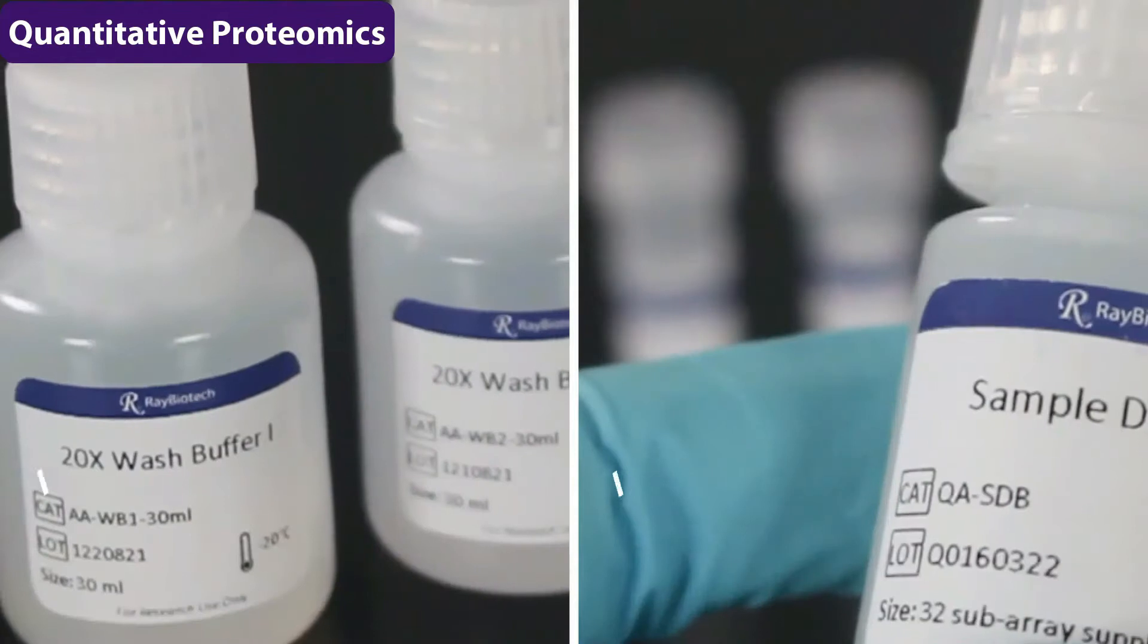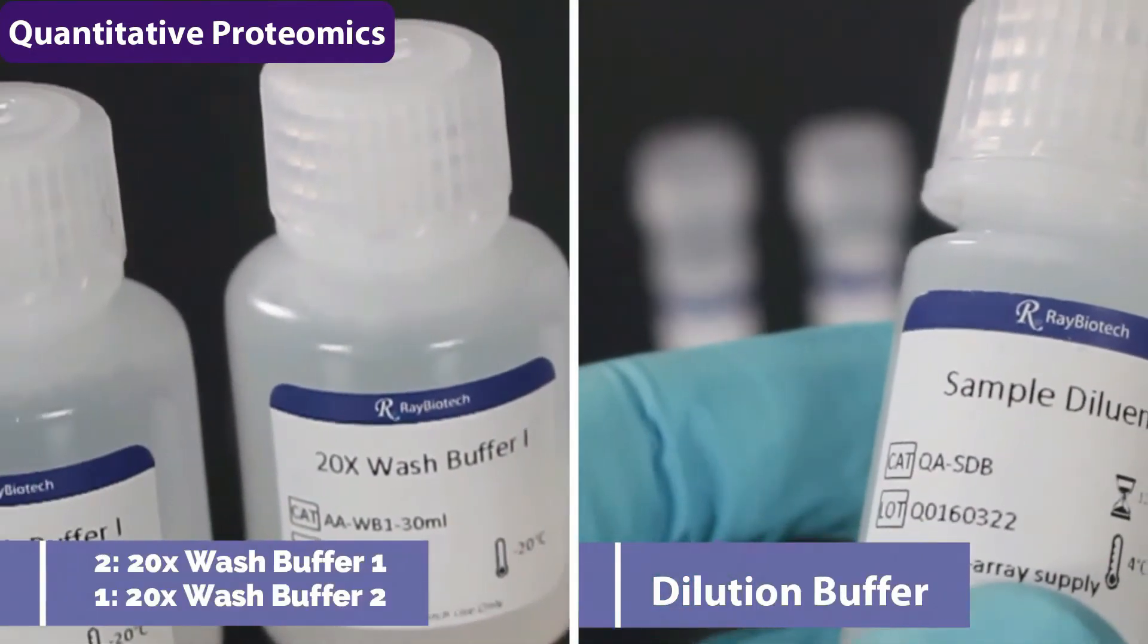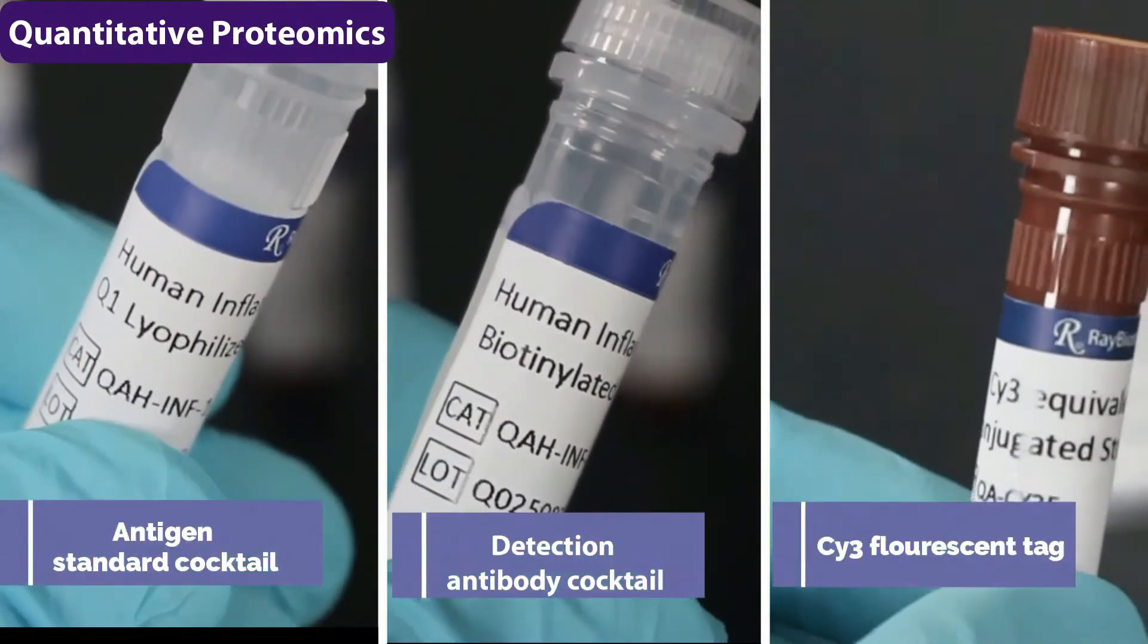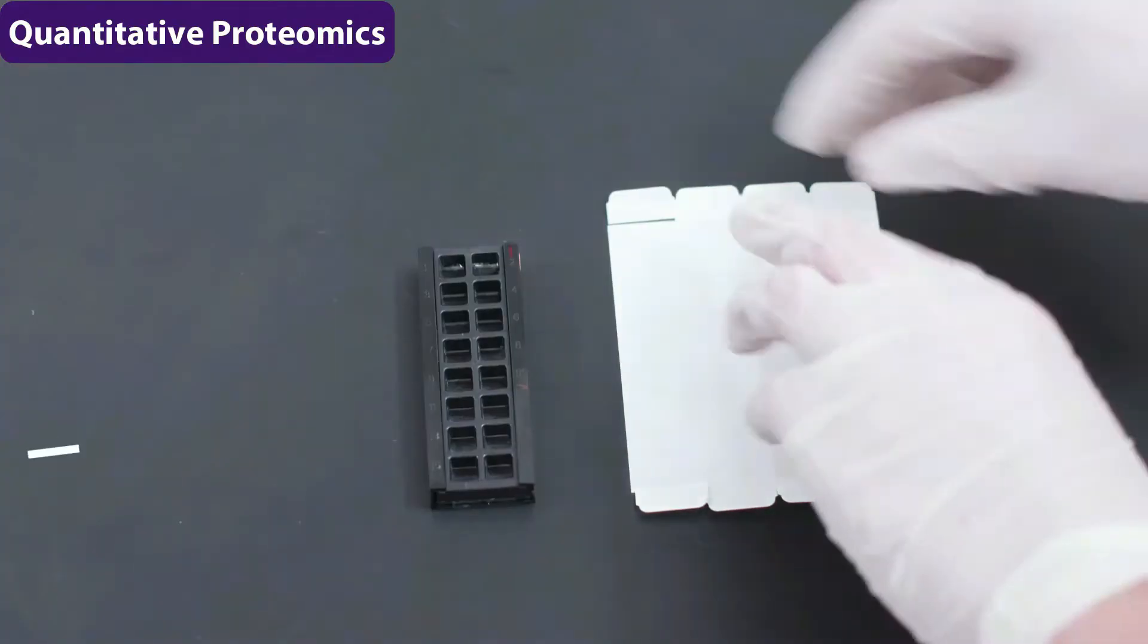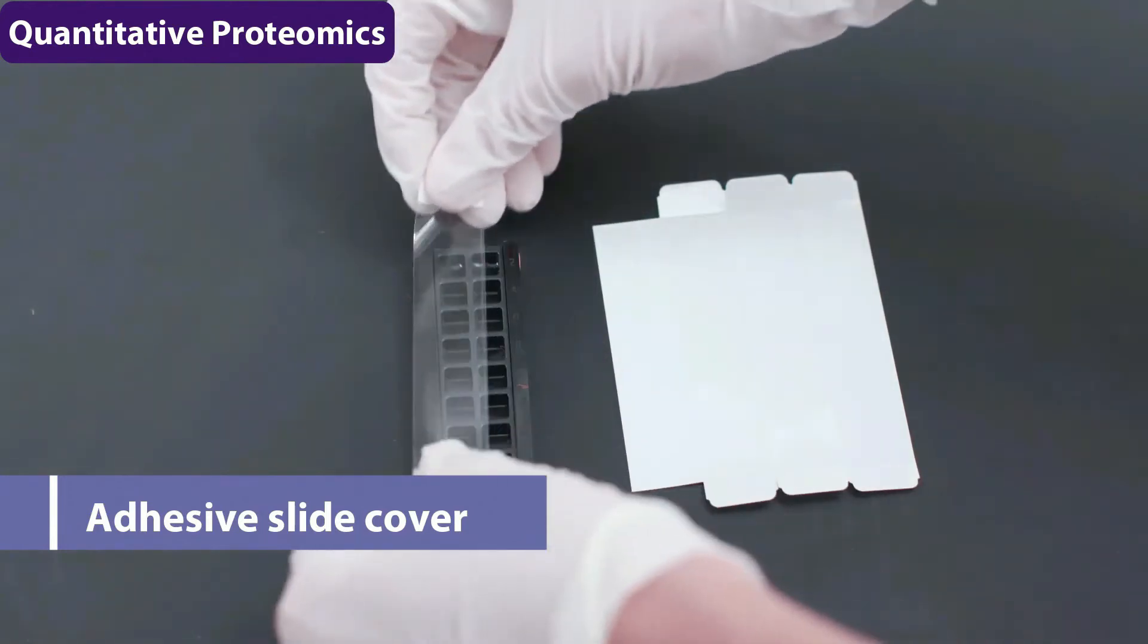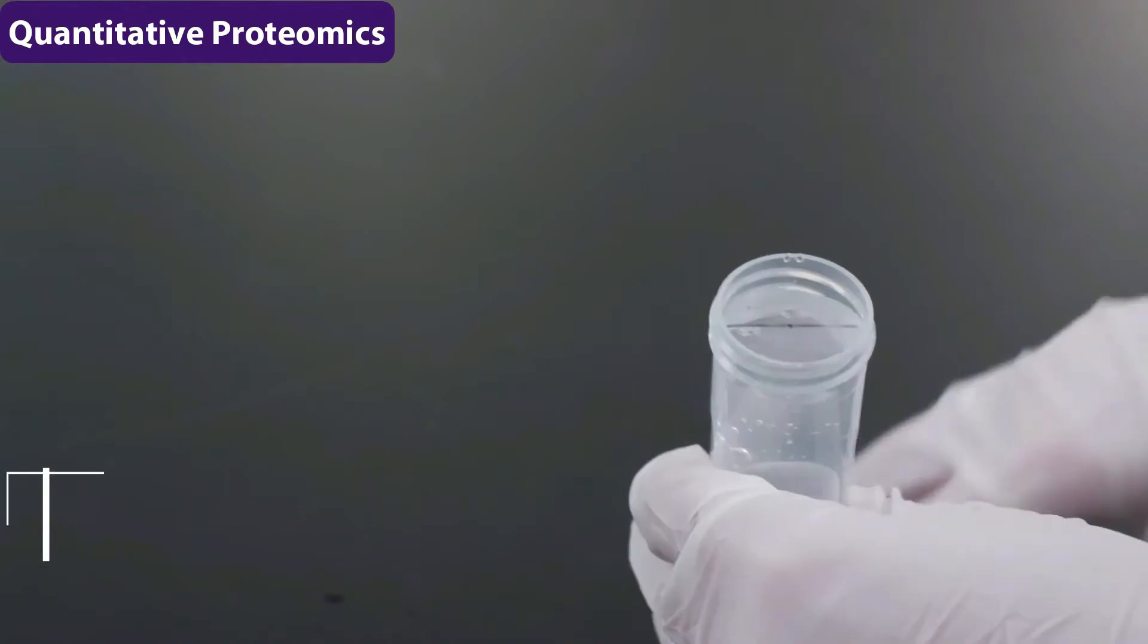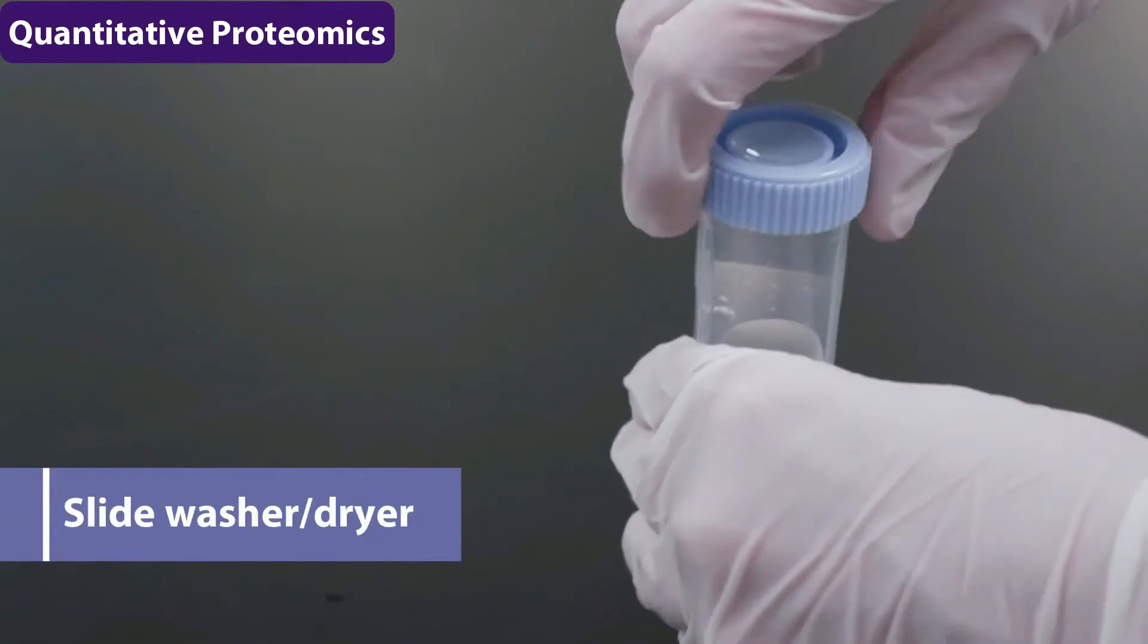The other components that you need are three wash buffers, two wash buffer one and one wash buffer two, in addition to a sample diluent. You also have your standard antigen cocktail, detection antibody cocktail, and your fluorescent tag, which is Cy3. To minimize contamination, we have also included some adhesive slide covers to be used with each incubation. The 50 milliliter conical tube with slide inserts is what we're going to call our slide washer dryer.